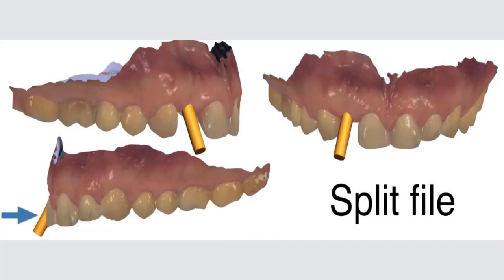So even when I position my implant during the fenestration, here shows to me that my restoration would go buccally, right? I would have that inclination. I have shown this case to other people and guys. They said, Nelson, why don't you fenestrate more?